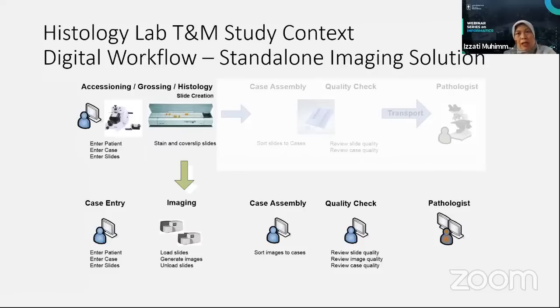Many pathologists in Indonesia really hope that this setting will become part of their clinical practice, because reading under the microscope is very tiring. You can imagine, when there is a screening period, say for pap smear reading, the pathologist has to read about 500 slides a day.